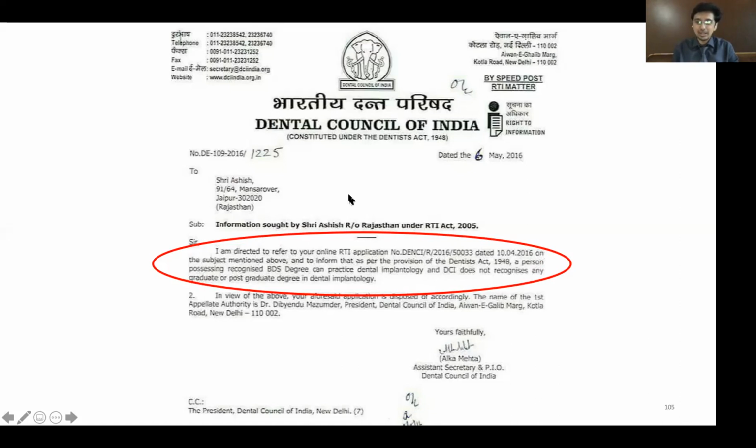Okay, about the plastic abutment, sir. This I'll explain with more photographs. Plastic abutment basically means, Hashit, that ultimately the abutment is completely melted in the process, and the crown and abutment are in a single process. So this I'll have to explain separately. I'm sorry for this because I need more photographs with regard to this. But as of now, implantology comes under general dentistry with specialists helping.